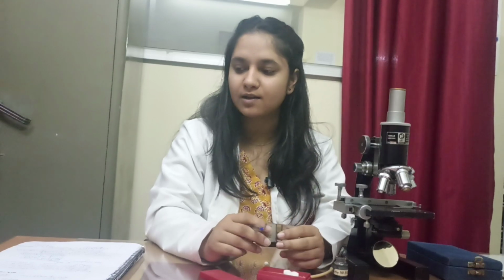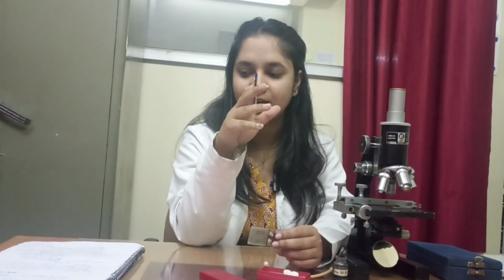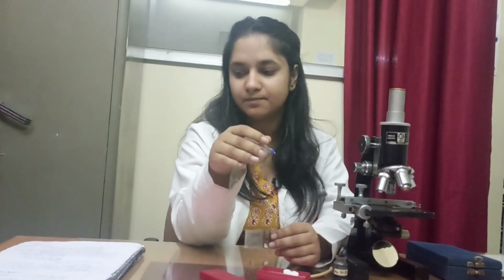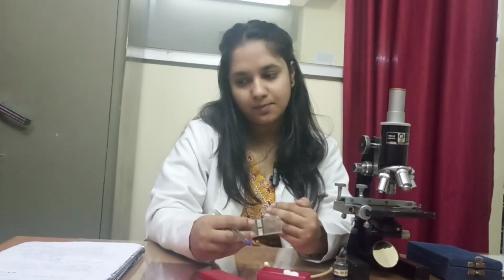So it is n into 20 upon 0.4, that is, n is the number of cells counted, and we should multiply it with 50. This is all about the WBC TLC practical.